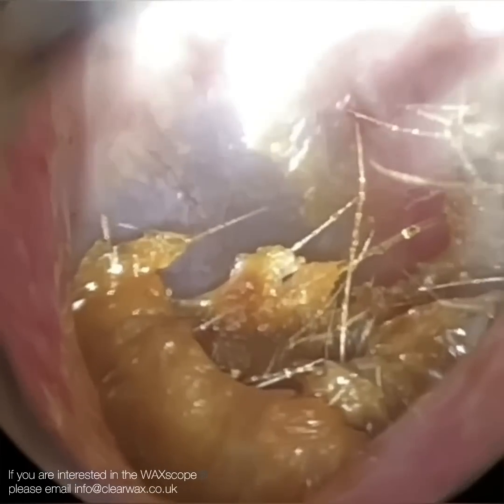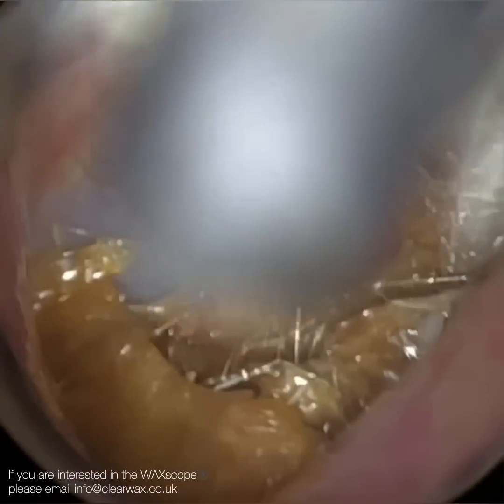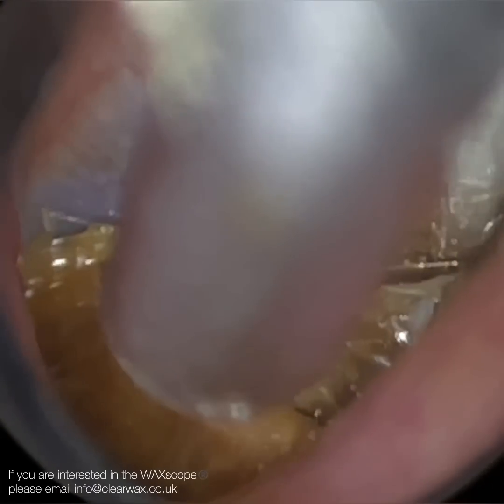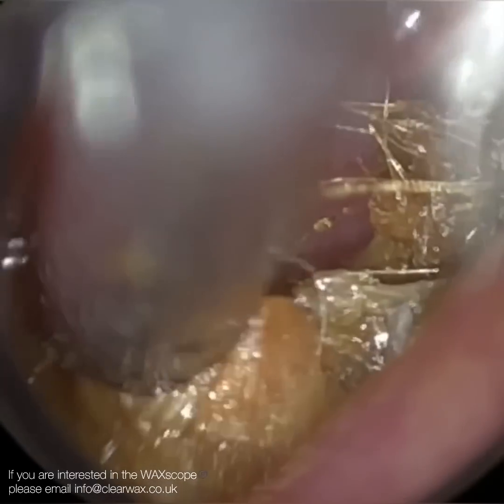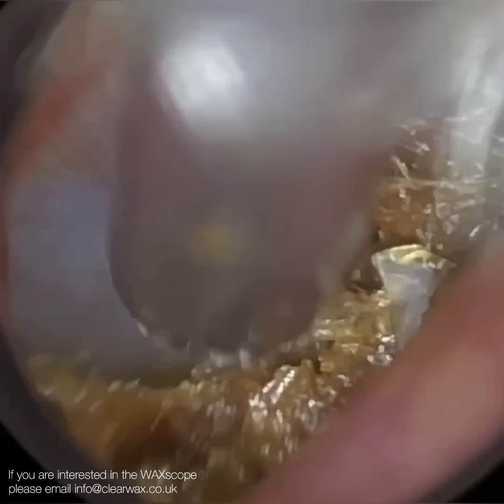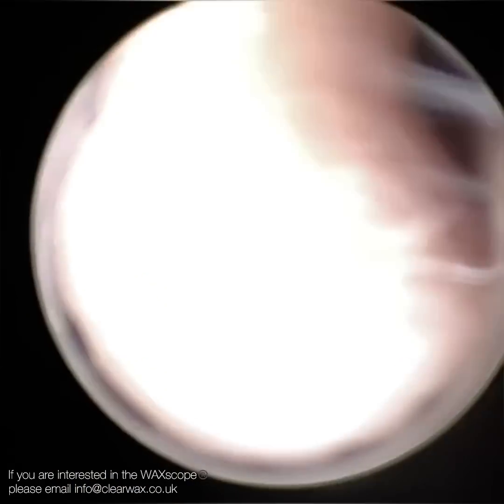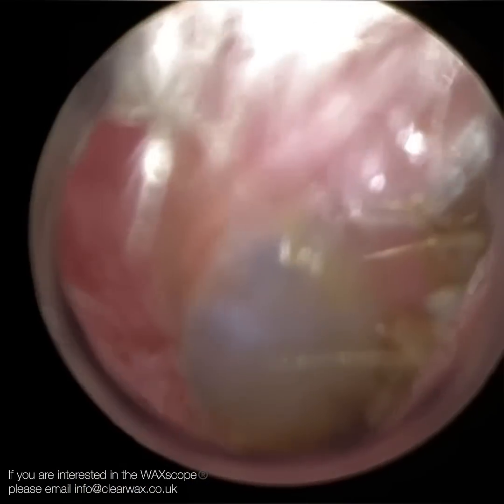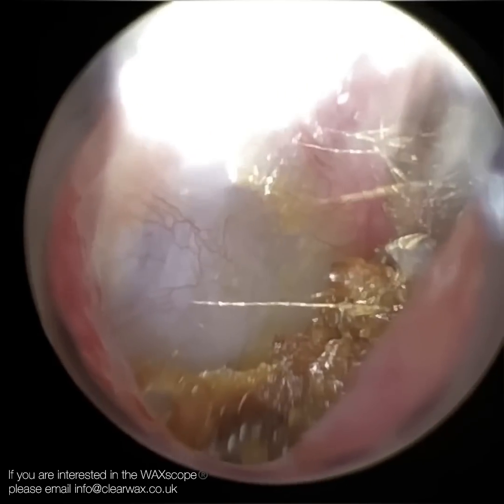When you use a speculum, you can stretch and straighten the cartilage portion of the ear canal because it's malleable and flexible — you can't do that with the bony part. Hence why for me the endoscope is still number one. In cases like this with the wax, you can see we removed the majority of it and the patient was able to hear much better at this stage, but I wanted to get the rest out. I have a feeling this wax had been there for a long time, given that they previously had to abandon a procedure due to pain.